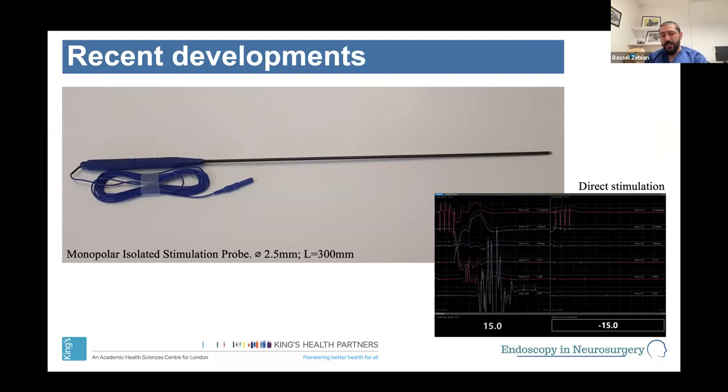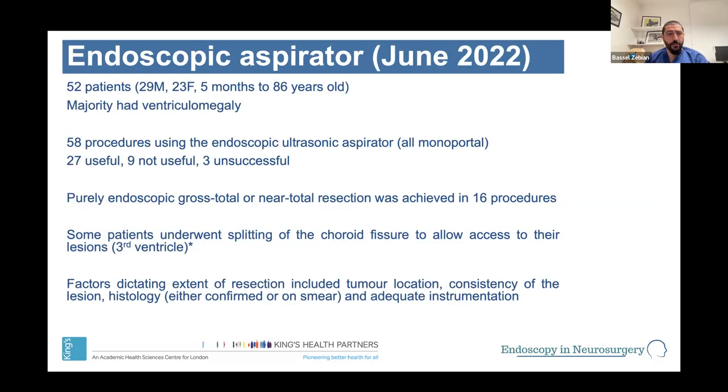Initially I thought, well, there's CSF, or fluid, everywhere, so you're not going to get anything at all. And now, by just mapping the floor of the lateral ventricle, you can find where the internal capsule is likely to be in relation to the tumors that you're trying to get into that way. It's really useful for thalamic tumors specifically, if you're trying to get onto them from the top. You'll see us use it in one of the videos shortly.